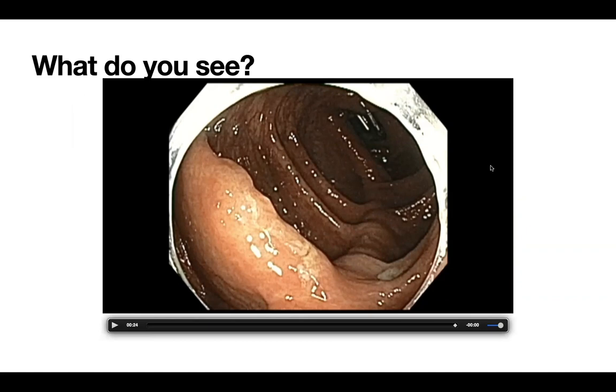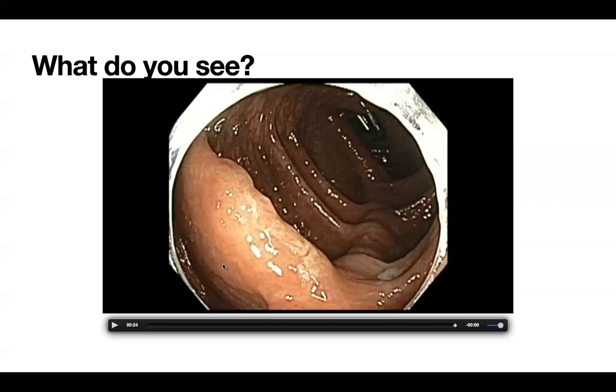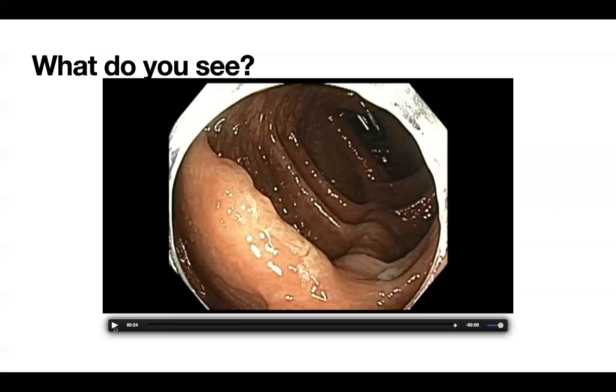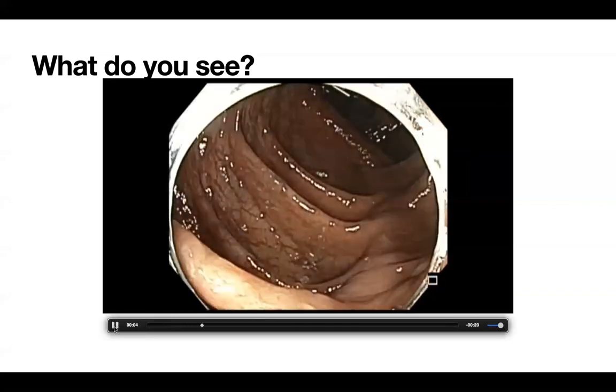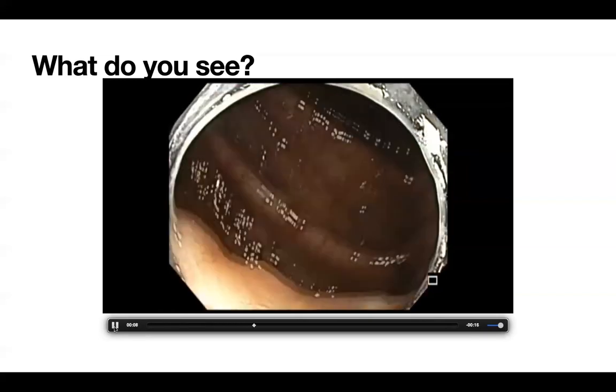Okay, that's good. So let's look at the polyp itself. I don't know if you have NBI pictures, but it does look like a flat polyp, probably an adenoma. I would like to see the other side of the fold to be able to judge the extent, whether it is spreading beyond that fold or it is just on the fold. And it looks like something that can be removed by EMR.